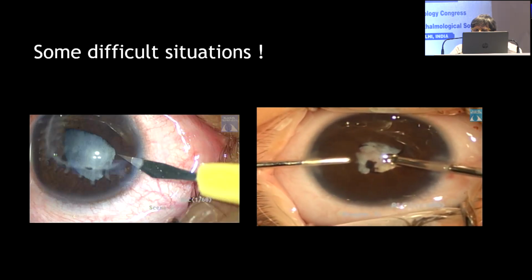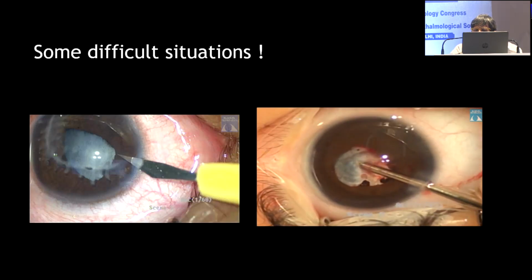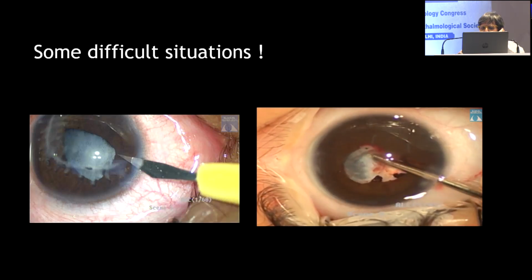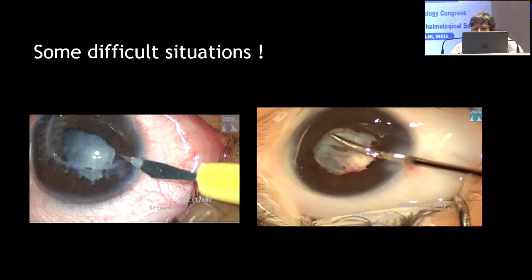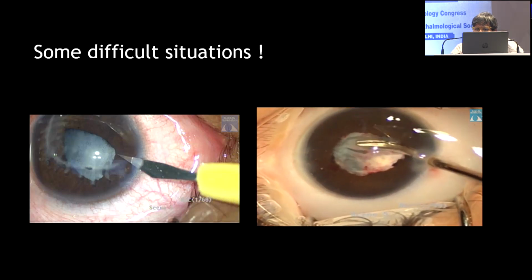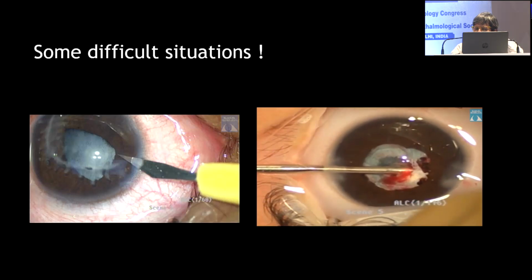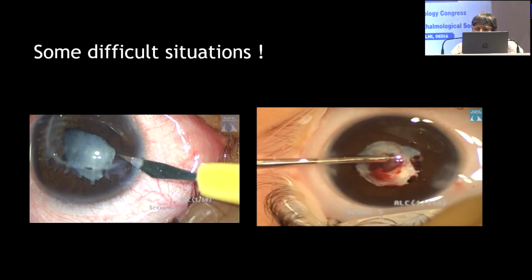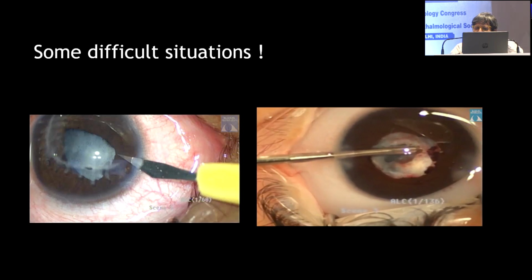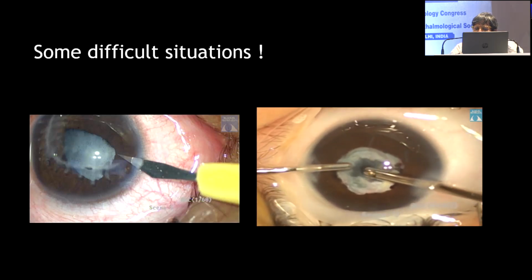So I've done a little bit of a pupilloplasty using a vitrector, and that really dilates the pupil, and then it's only a matter of patiently cauterizing every blood vessel which is going across, and using scissors as well as cautery in conjunction to fashion a visual axis which is clear of the cataract.